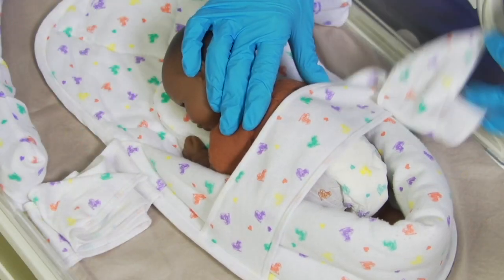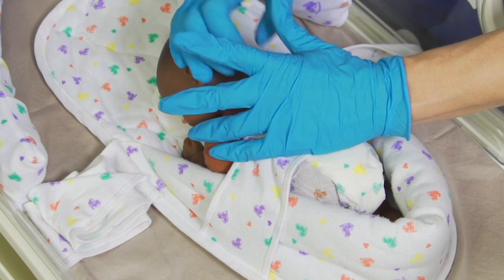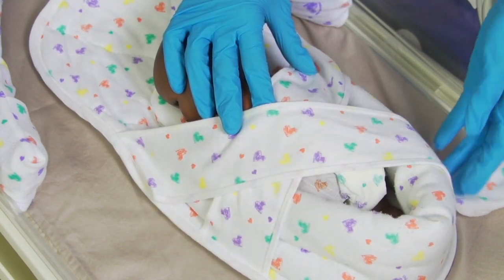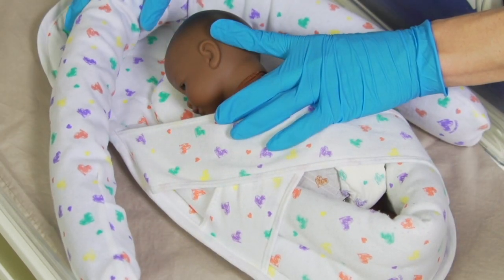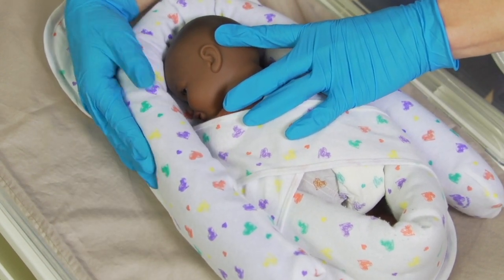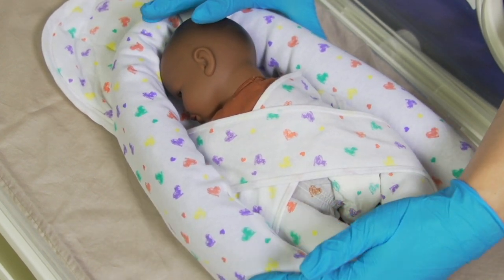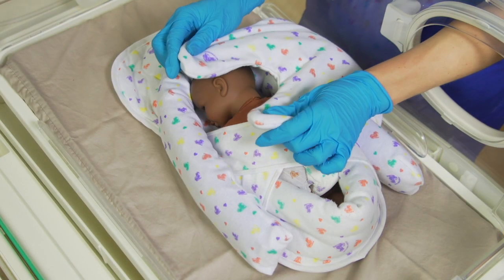Adjust the straps to provide containment, while also allowing for dynamic movement at the hips first, then shoulders. Moving slowly, following the infant's cues, round the bendy bumper to rest against the infant's head to comfort and contain. The bendy bumper continues around the back and outside of the Snuggle Up. If the infant arches his or her head and neck, Frederick T. Frog's hands can assist in containment.